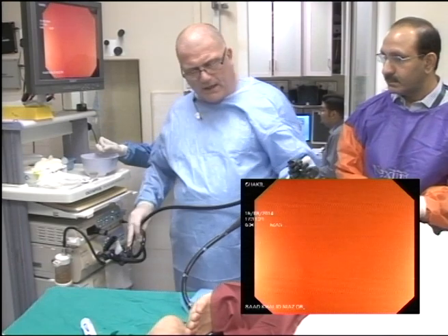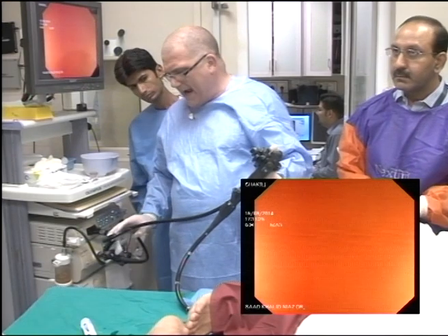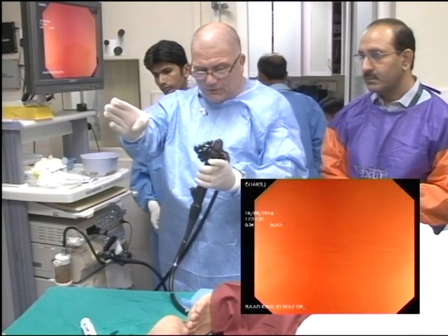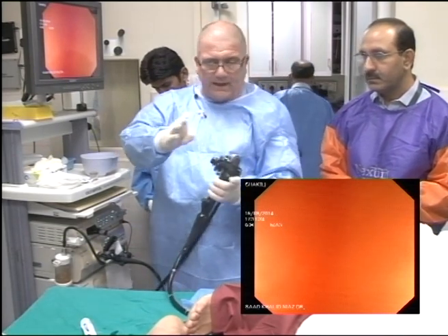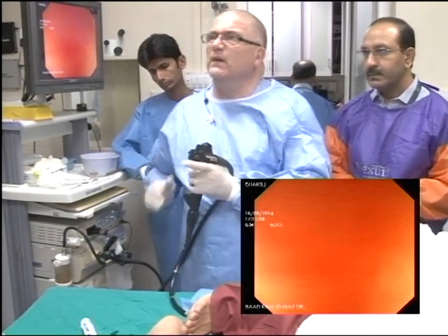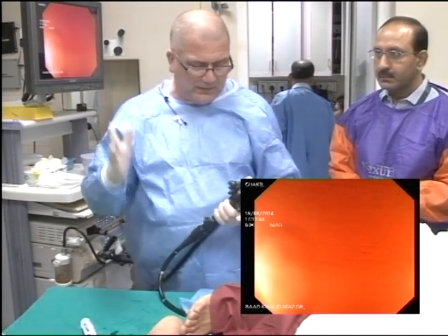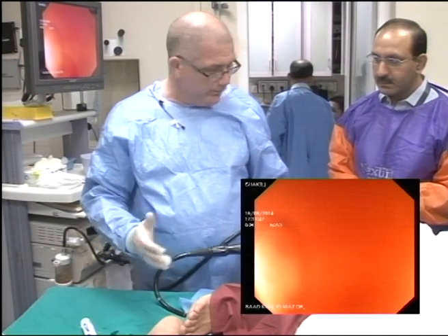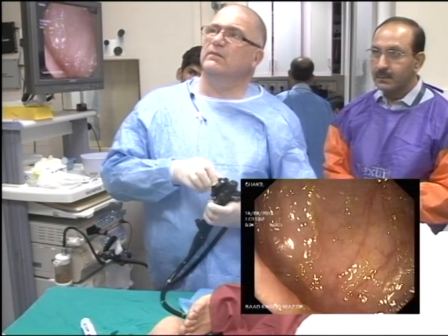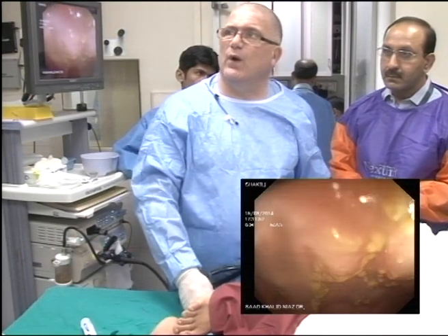So what I've done now, I want to put anti-clockwise torque in the scope. I've actually put the anti-clockwise torque and the buttons are pointing over here. If I now turn the scope back, I'm increasing the anti-clockwise torque, but the tension is in the umbilical. So I don't have to then force the scope round with this hand. I can leave this free and I can put the torque in the scope. So that's what that's about. I know where the scope wants to go, but the scope doesn't want to go.